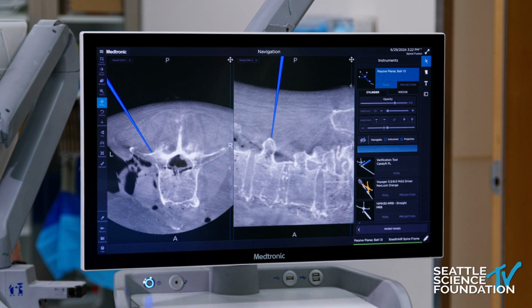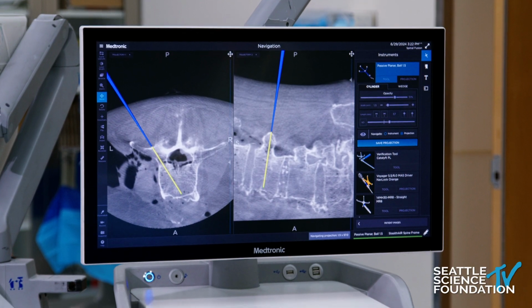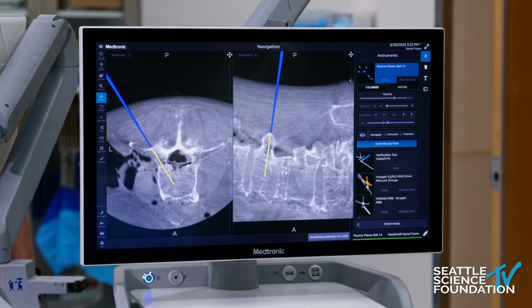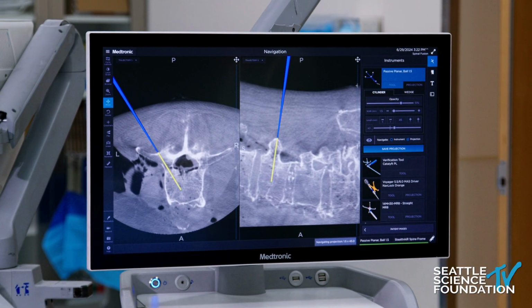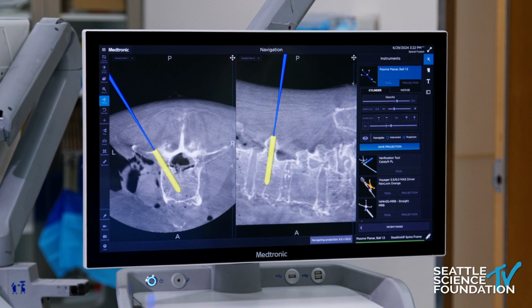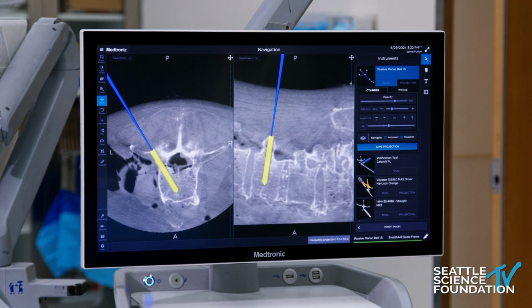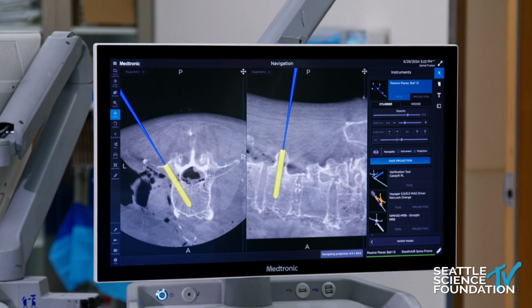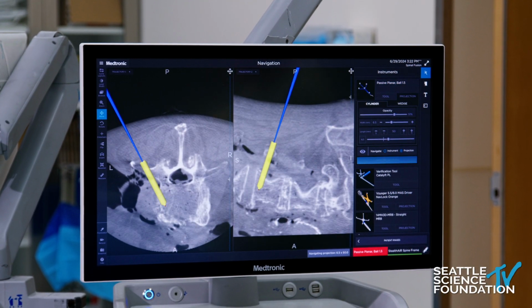So I'm at L3 here, and now I'm pointing towards the trajectory for the entry point for the pedicle screw. I will ask the assistant to simulate a screw, just so I know in terms of length and size. So maybe a 6.5, 45 or 50 or something like that. Some surgeons like to drop the screw so it's there. I just do this for sizing now. So this seems like a reasonable size pedicle screw, so I'll take this out.